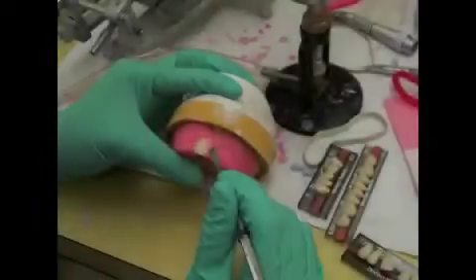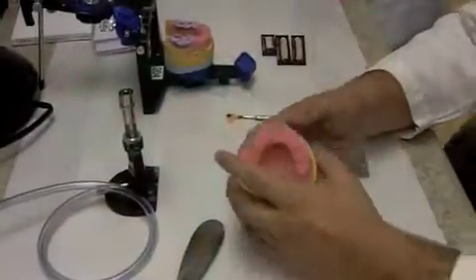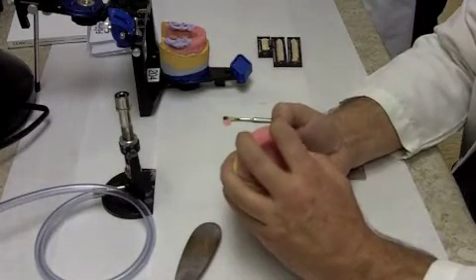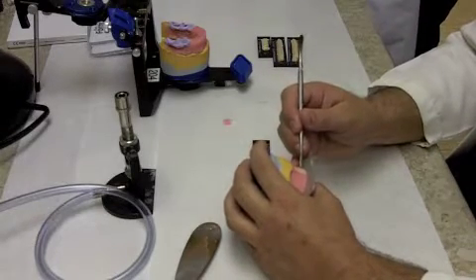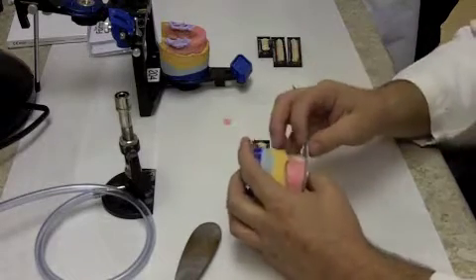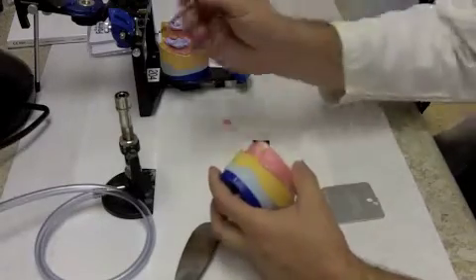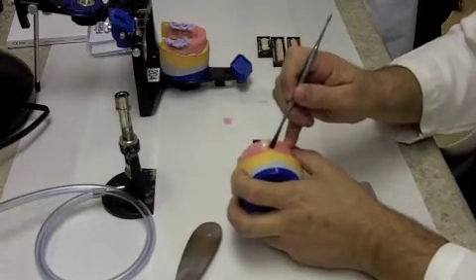We're going to start off by placing our central incisors. We want to use our rim as a guide, so we're going to take out some wax so that we can actually set the central incisor. You want to have enough wax removed to have room for the teeth, but still leave a little bit of wax in that area so you can position the tooth. We've established our occlusal plane and the facial contour of our rim with our patient.